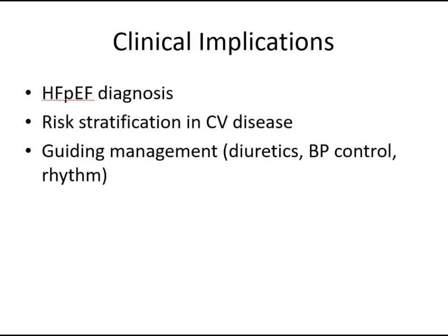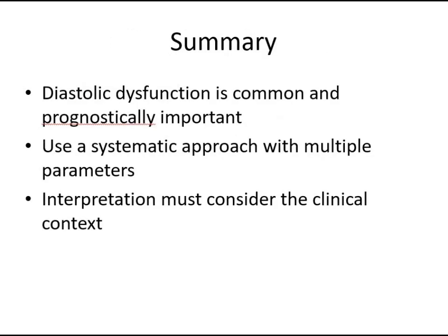So why does this all matter? Understanding diastology is essential for diagnosing HFpEF, risk stratifying cardiovascular disease, and helping guide therapy. Let's wrap up. Diastolic dysfunction is common and carries prognostic value. Always use a systematic, multi-parameter approach, and above all, interpret in the context of the patient.